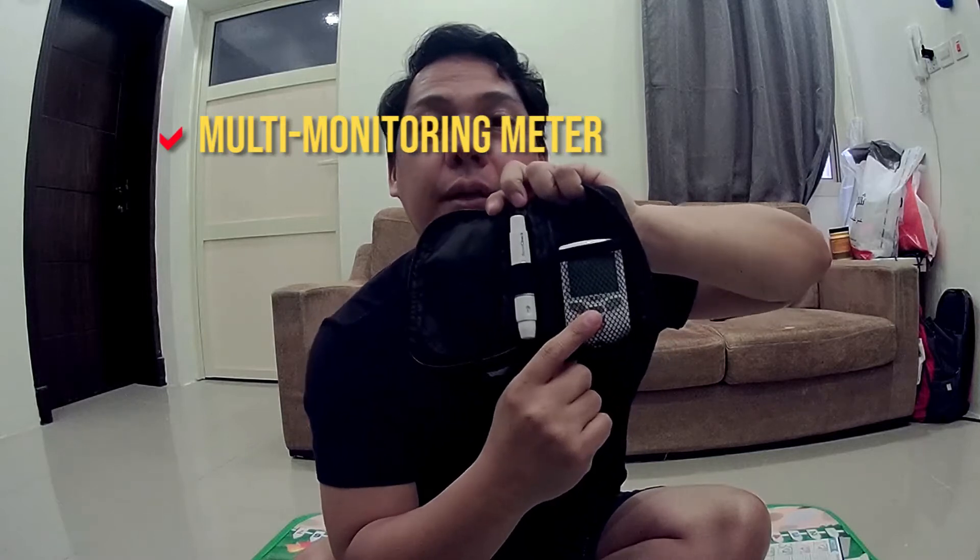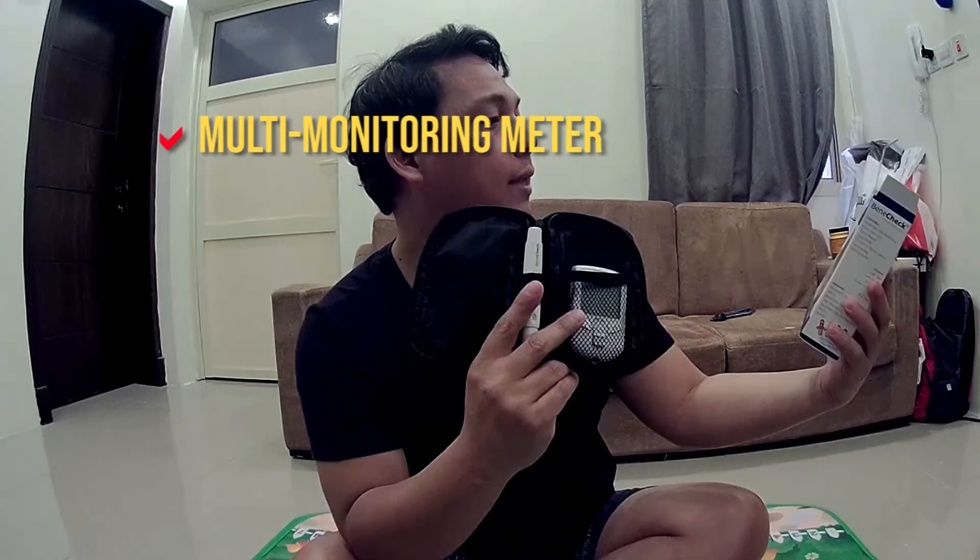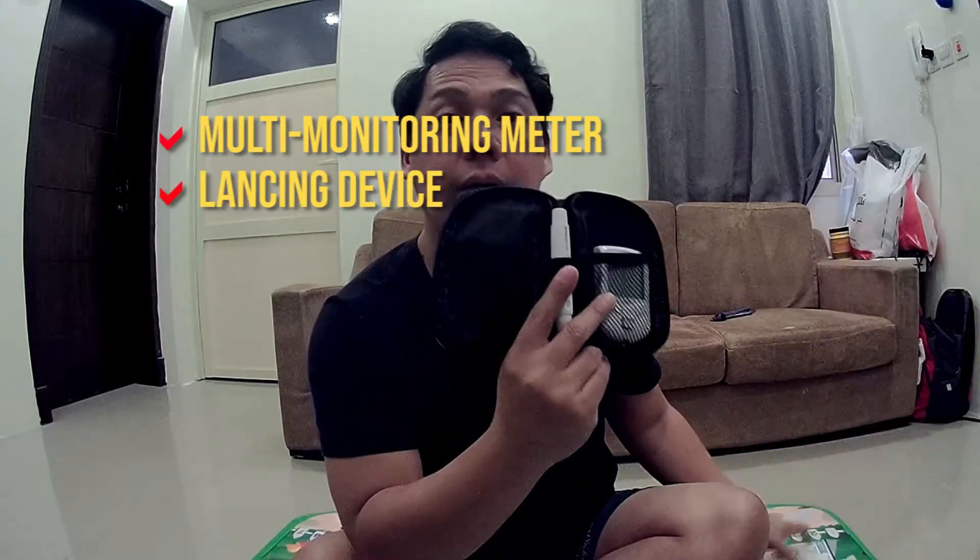When you open the pouch you get two items in it: you get the multi-monitoring meter and the lancing device. This is where you insert those smaller needles to prick your finger to get the blood out. Since this device is a three-in-one meter, you need to have three types of strips.